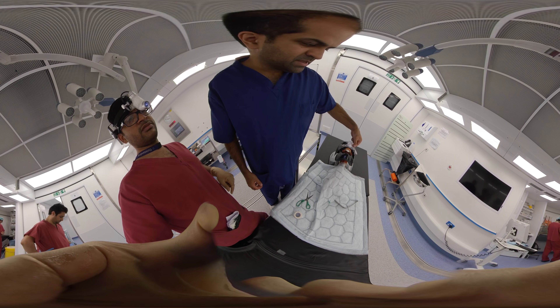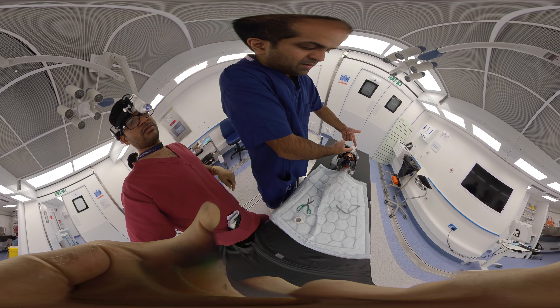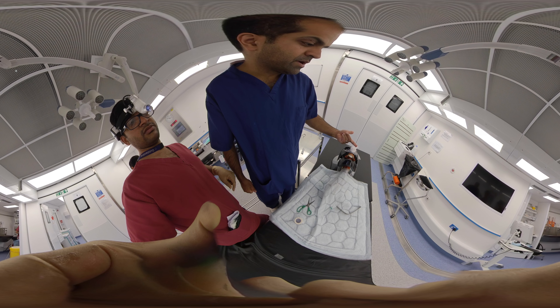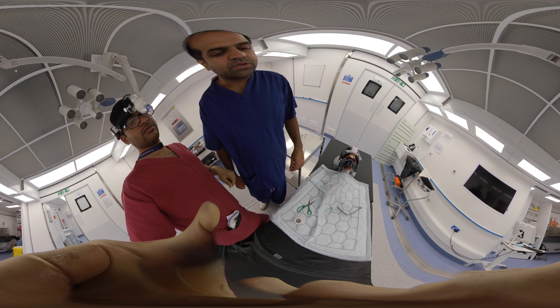Make sure there is not too much pressure pulling the nose out to the side. The piece of gauze is there firstly to prevent pressure from the umbilical clamp, because pressure equals force over area — by increasing the area, we reduce the pressure.